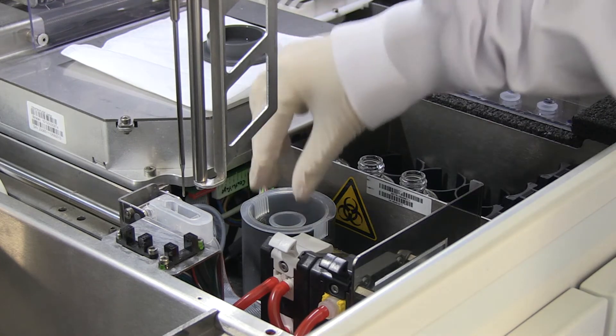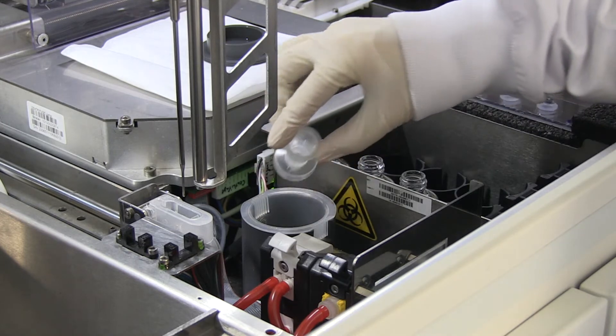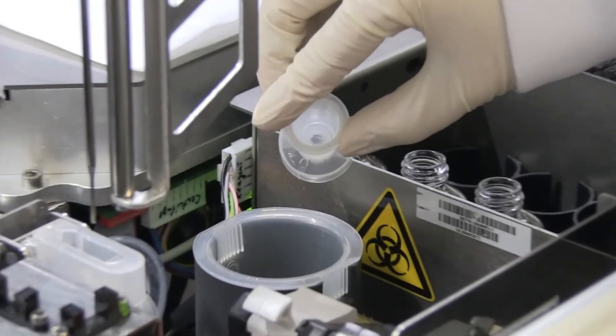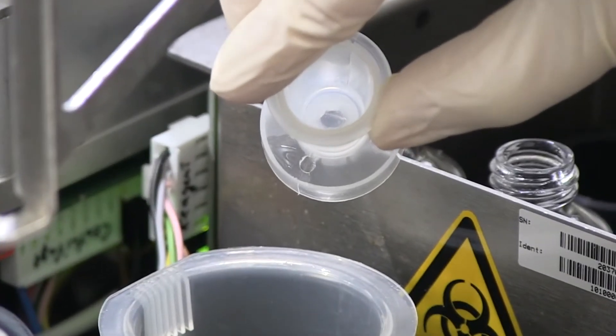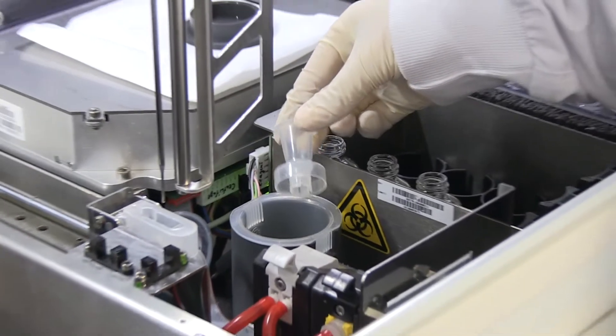Inspect the suspension cup visually. Make sure the suspension cup is empty. Replace the suspension cup if it is dirty or damaged, as described in Chapter E3.2.